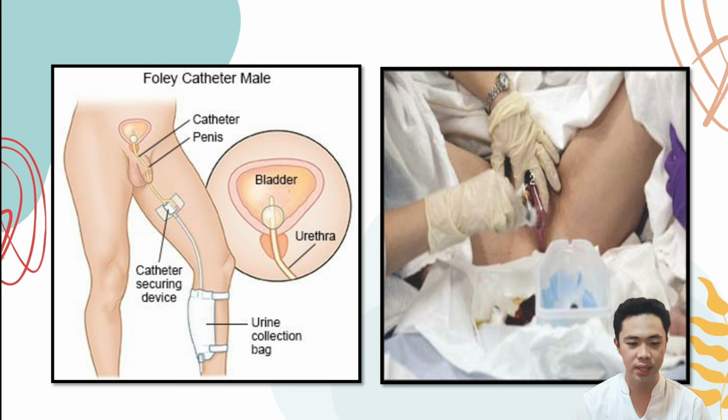Collect a urine specimen if needed. For a straight catheter, allow 20 to 30 ml to flow into the bottle without touching the catheter to the bottle. For an indwelling catheter, pre-attach a drainage bag. A specimen may be taken from the bag this initial time only. Allow the straight catheter to continue draining into the urine receptacle.